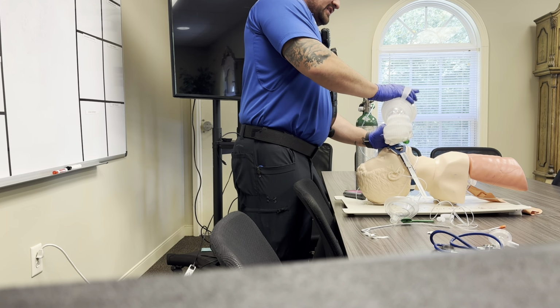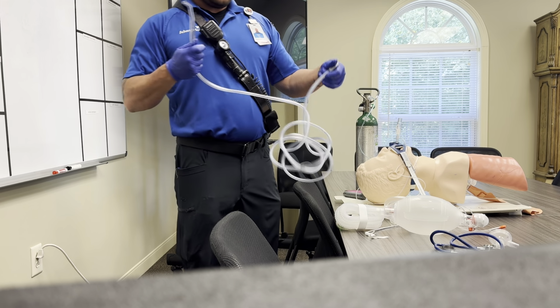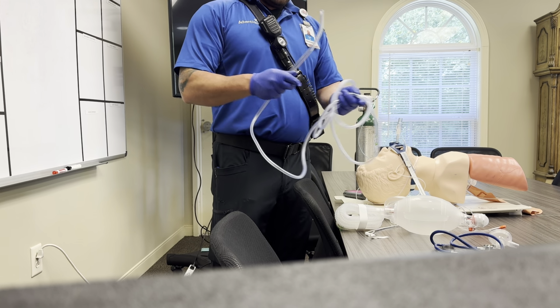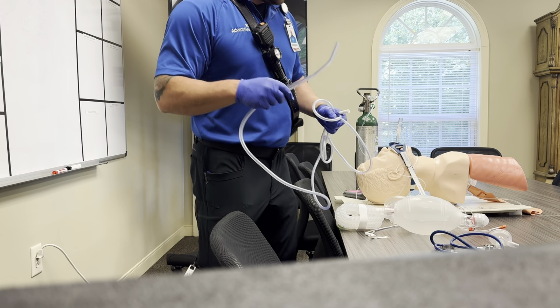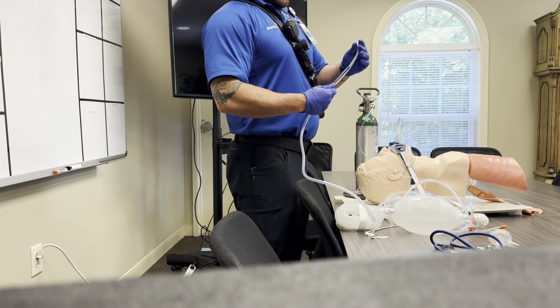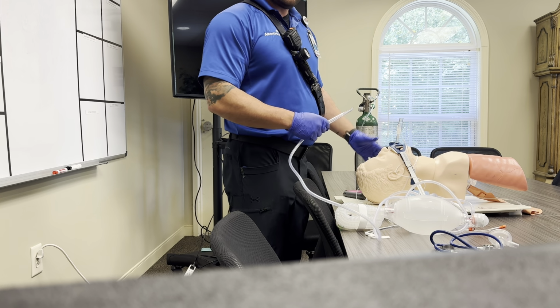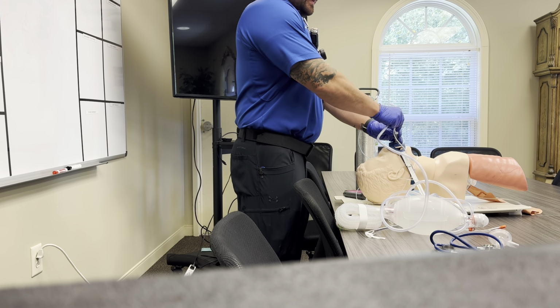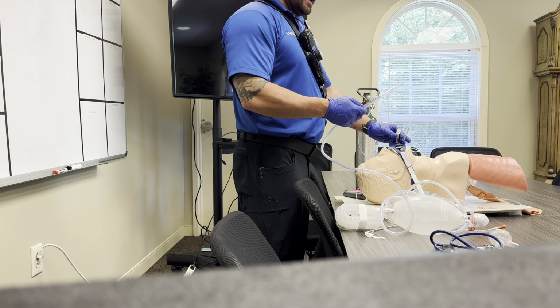Lastly, one point that we need to discuss is suction. Again, this would be placed onto either your suction canister that's mounted in your truck or your portable suction. We use a Decanto suction catheter, I guess you can call it. I love it personally. It's great. It's got a very wide open tip. So if you do have to suction any secretions, let's say this patient's bleeding in the mouth, big wide tip so you can suction. It does make it a little bit difficult on these smaller tubes if you were to need to suction the tube.